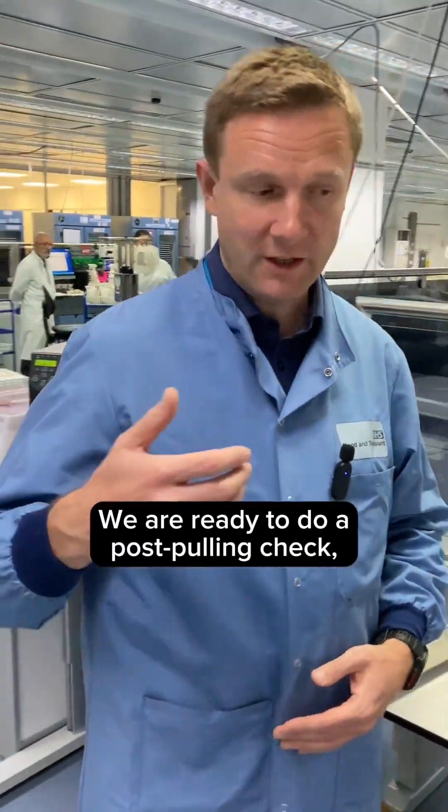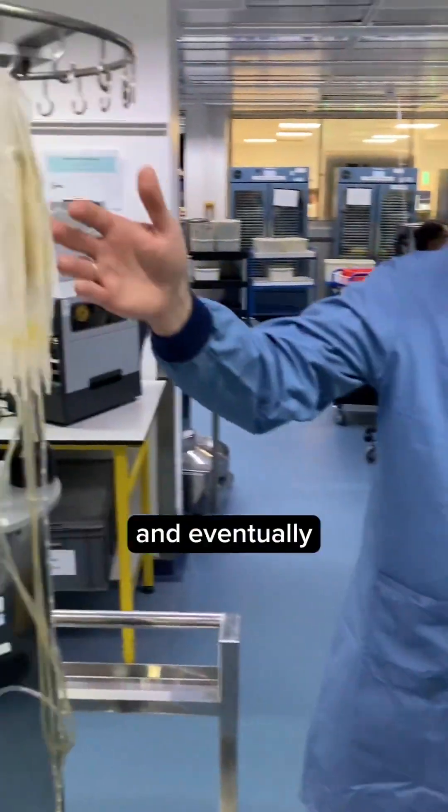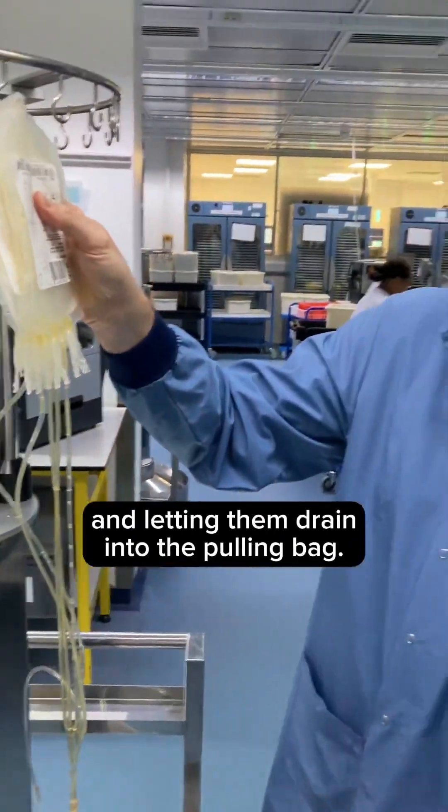We're ready to do a post-pooling check — again verifying that the right packs have been connected — and eventually hanging the packs of the individual cryo units and letting them drain into the pooling bag.